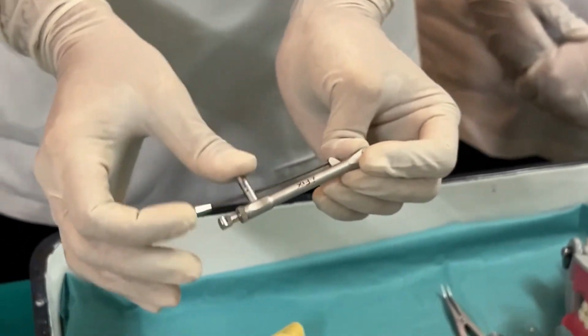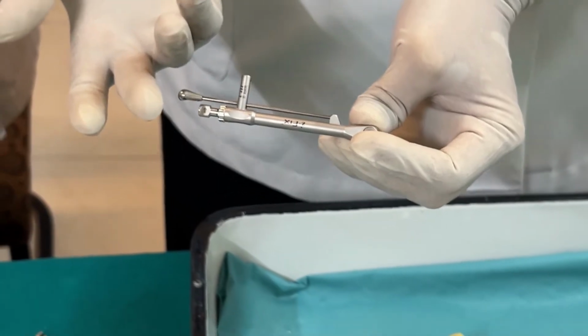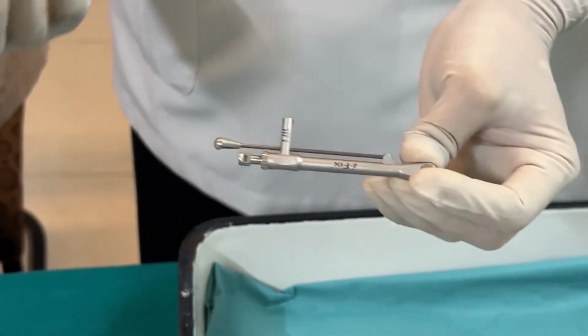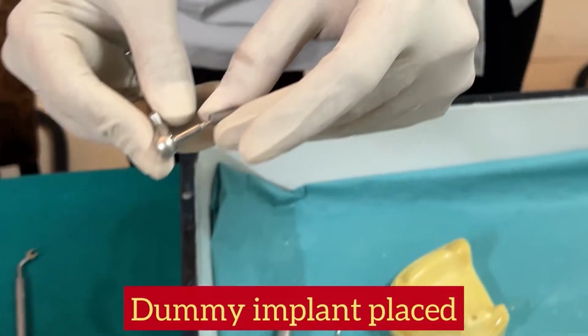Suppose hardly any torque you are getting, that means you have over widened your osteotomy. Your implant might fail because primary stability won't be there. So better take out the implant and place a wider implant. If it is too tight, widen up the osteotomy. Okay? So now I'll be engaging this implant here.